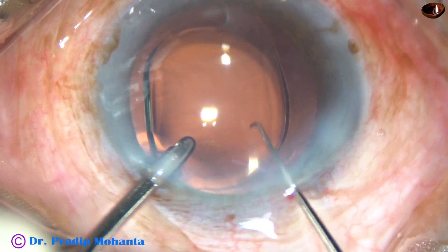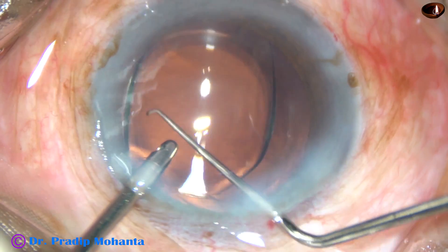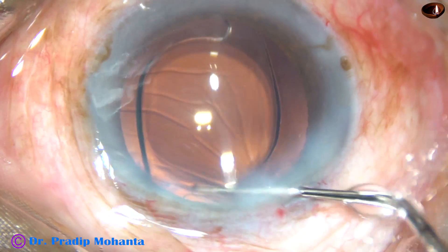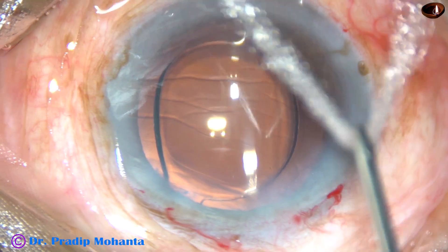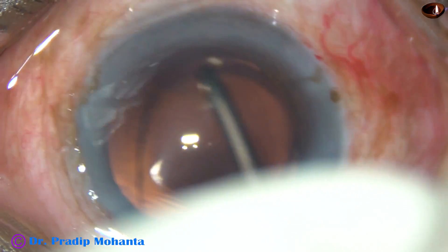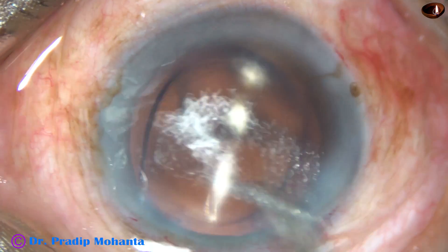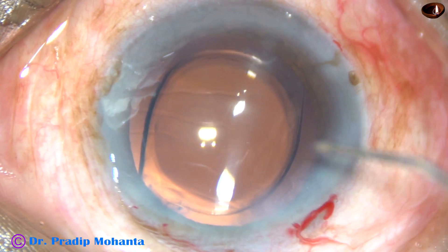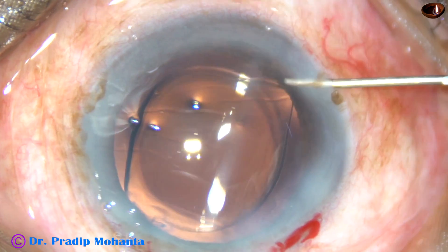Now this is how you check whether the lens is in the bag or not. The lens is in the capsular bag. There is no viscoelastic substance in the anterior chamber and capsular bag.